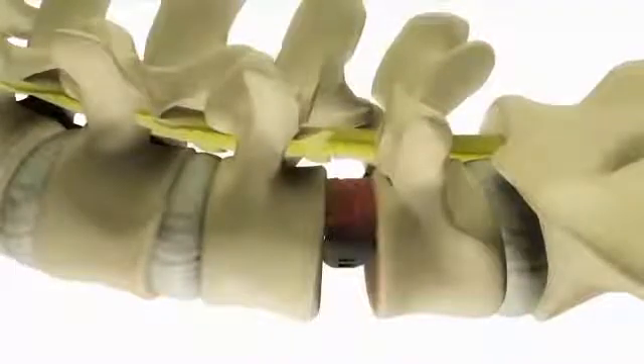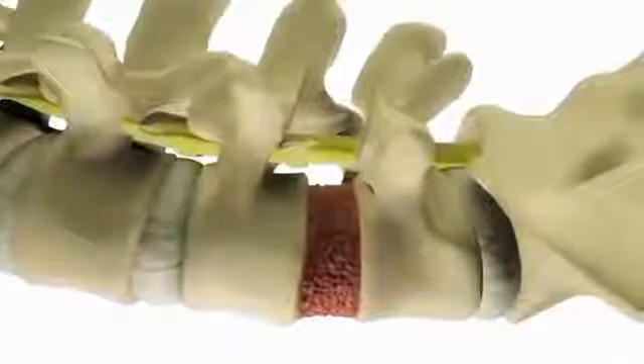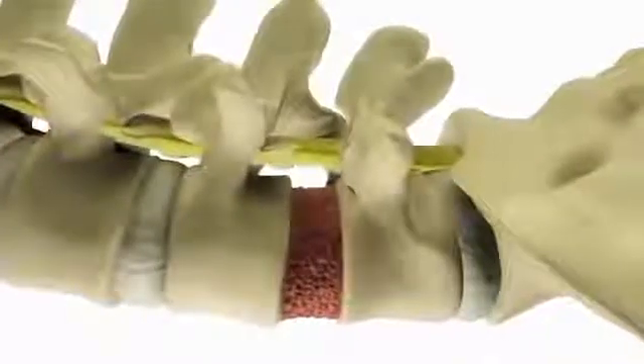The surgeon then places bone graft or other special material into the space around the implant to stimulate bone growth, which will take several months.